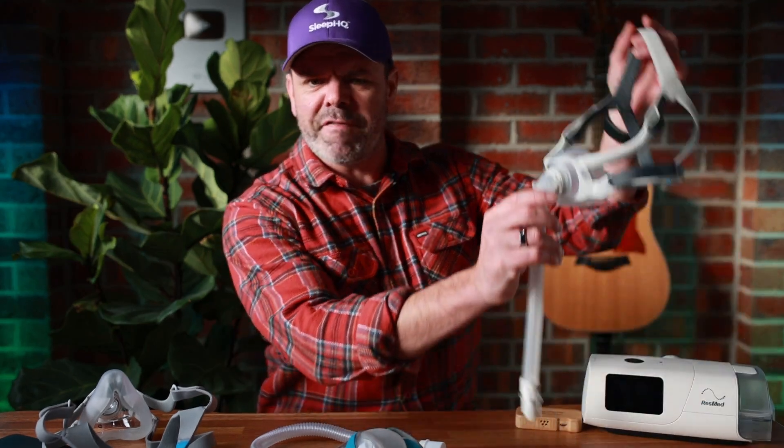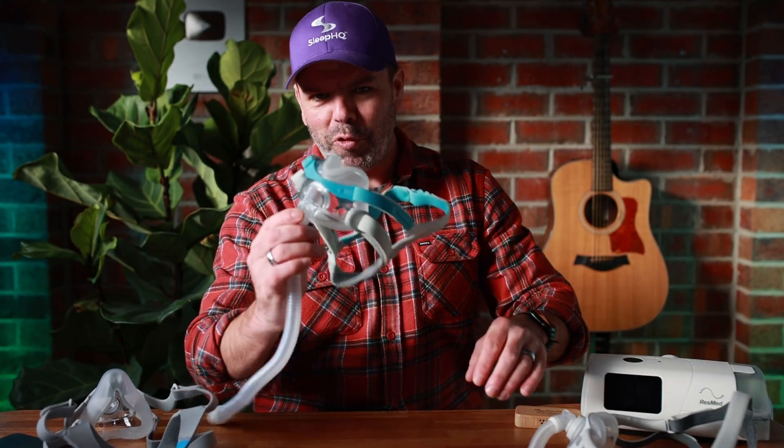G'day mates! A few weeks back I was checking out the seal performance on some of these top-selling CPAP masks — the F40, the Evora Full, and the F20 — and the Evora Full came out on top. However, back then I had a beard, and I thought maybe we should do the test again without the beard. I've got a bit of stubble, a few days' growth. We'll do the test with the stubble now and then go inside and have a proper shave and compare the results. We've got beard, stubble, and clean shaven.